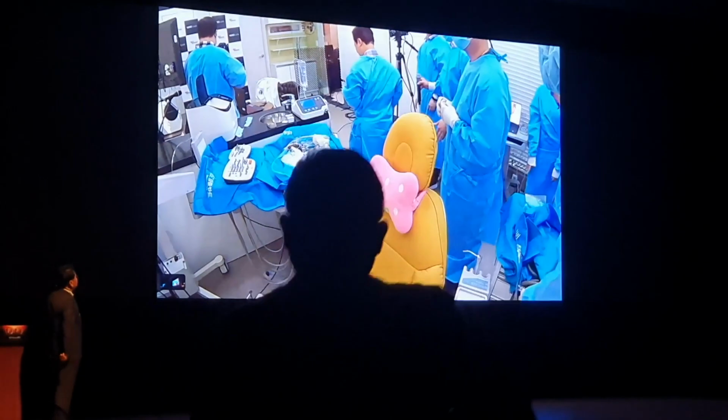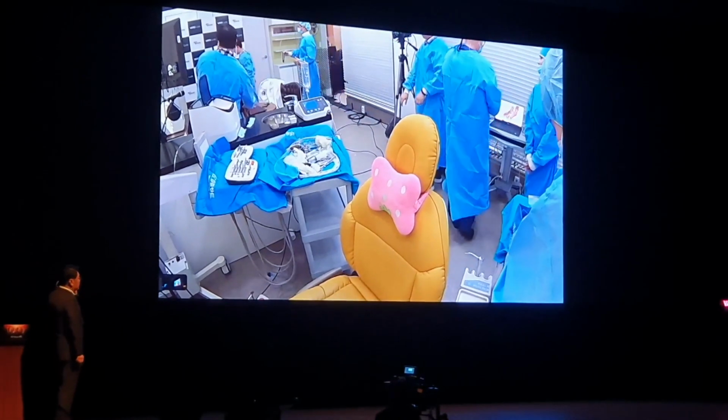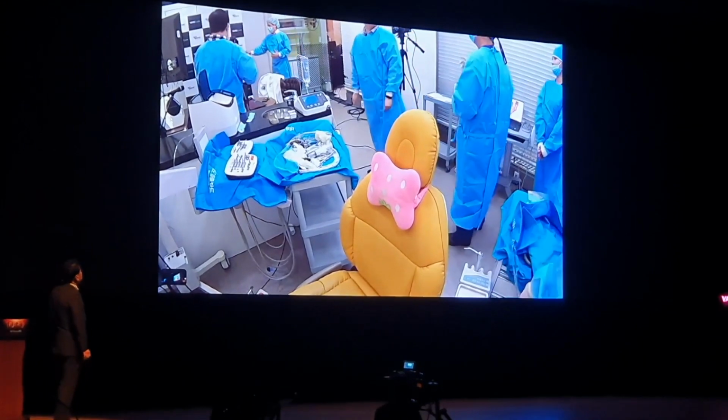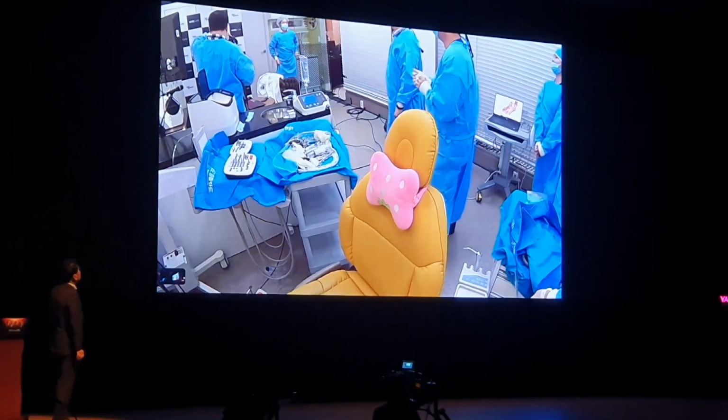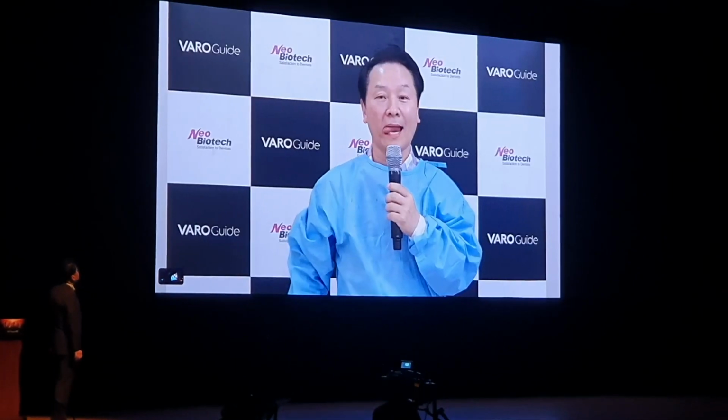So the healing abutment is connected inside the mouth. We'll have a brief interview. Oh, I forgot to do the torque check. We had more than 40 Newton centimeters. I don't think we need it.